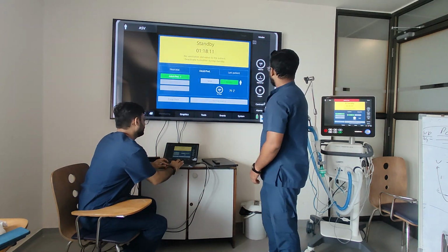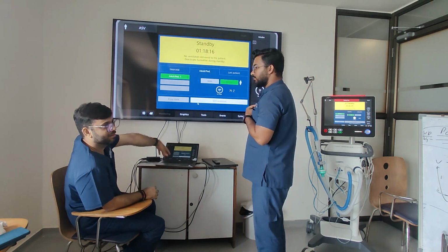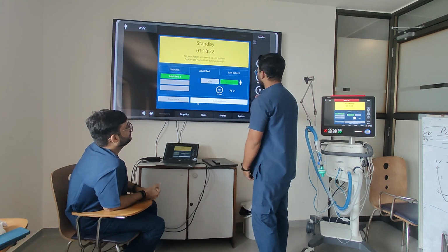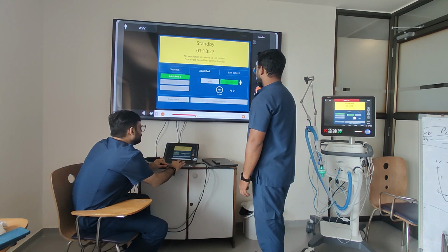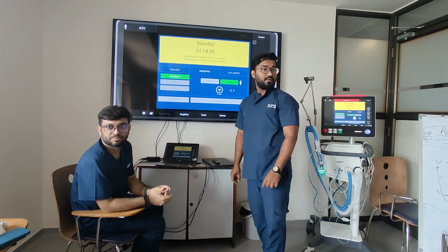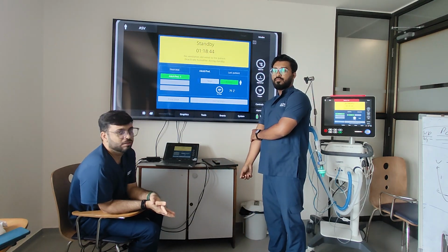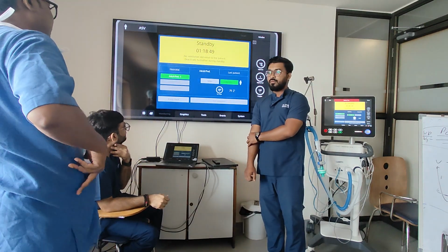Okay. Unit volume percentage. So I go there. No. Let him do it. No. How? Let him do it. I'll operate from here. Okay. Check. Okay, apart from that, 100% will be set. The percentage volume, how much do you want to start with? 8 ml per kg. No. You want to help him, Ganesh? Yeah. So you call for help. See, he is more attentive than you.